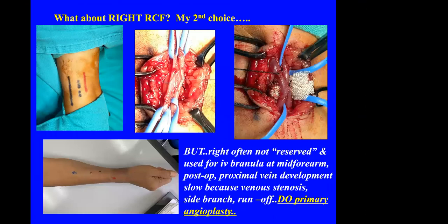If the left vein or artery is poor, the right RCF is my second choice. This shows the operation with the stay suture and posterior anastomosis performed, then after release of the vessel loops. If you do the right side, one disadvantage is that patients sometimes have had an IV cannula inserted proximally, causing stenosis proximal to the anastomosis — very poor runoff with dilated distal veins. In such cases you may have to perform primary venoplasty. I usually recommend an interventional radiologist for that, as I don't do them myself.